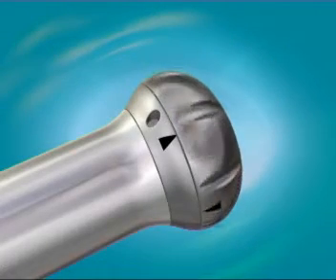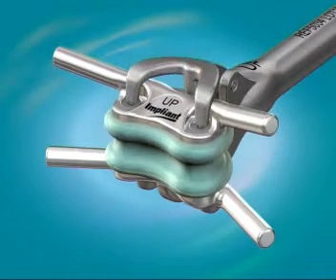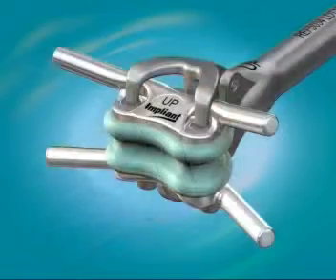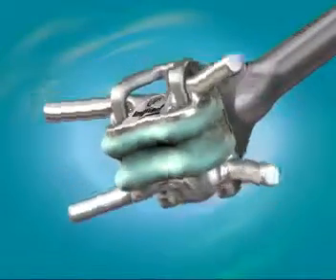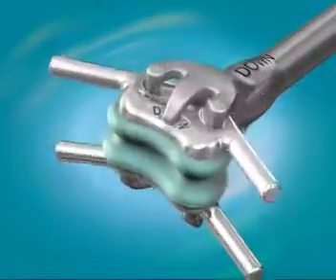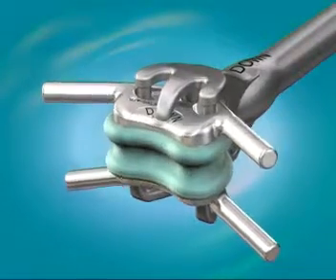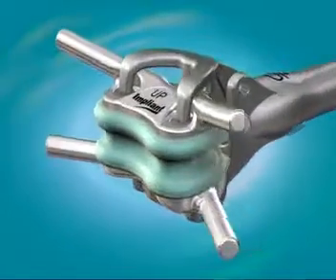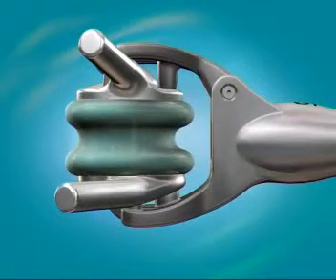With a clockwise motion, close the holder tongs. The 2 arrows will be aligned, verifying that you have successfully completed this step. As an added precaution, verify that the down marking on the holder matches the down marking on the TOPS device, and that the socket pins fit properly into the TOPS sockets.